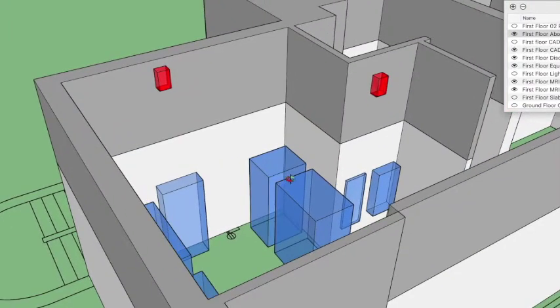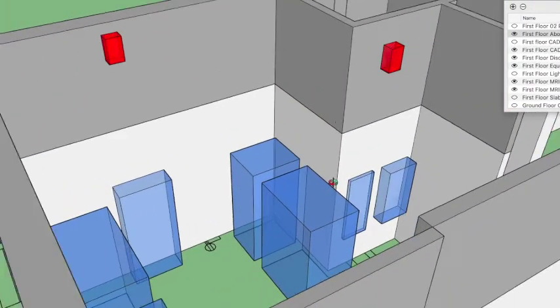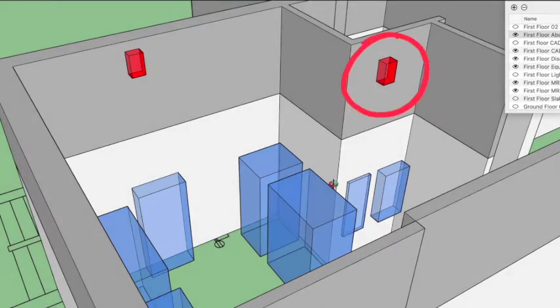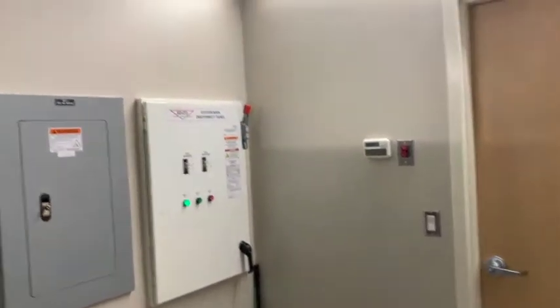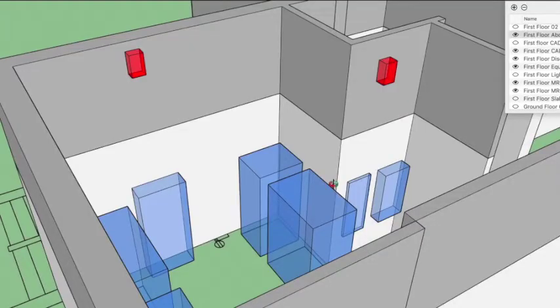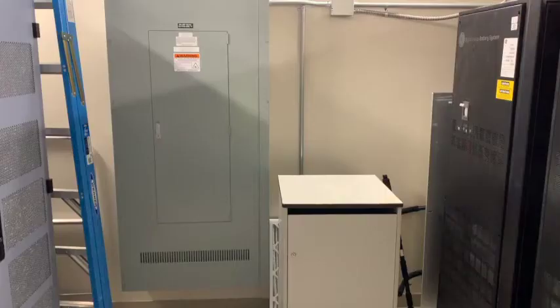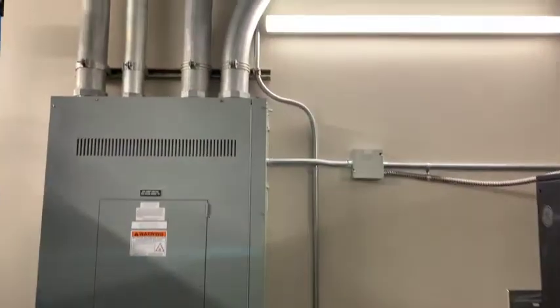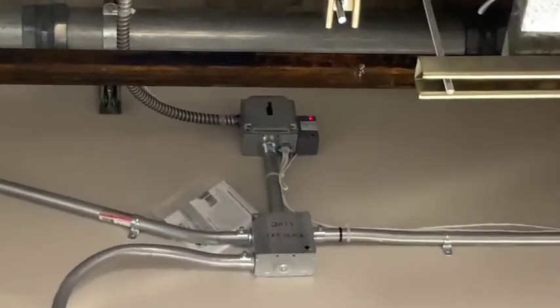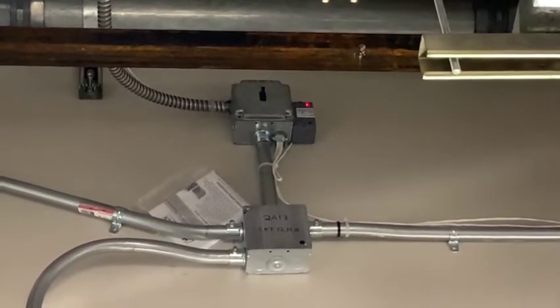Here you will find a zoomed in portion of the equipment room, with the first disconnect being on the right as soon as you walk through the door. Look above ceiling to locate it. In the event that this disconnect is tripped, please contact your facility or local maintenance personnel. Located here above ceiling is your second disconnect. This is your 20 amp disconnect for the fresh air intake. If for any reason it is tripped, please contact a facility electrician to investigate.